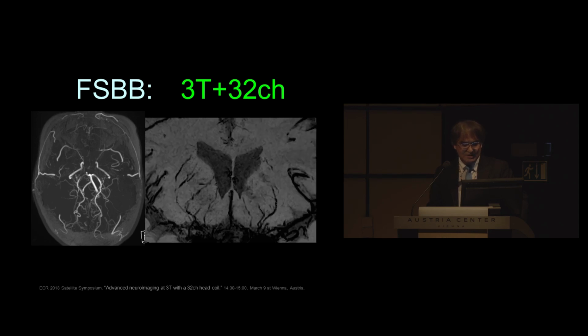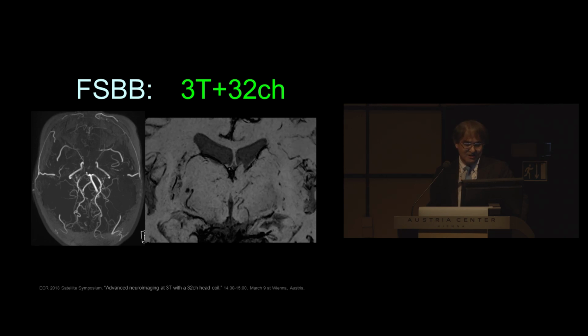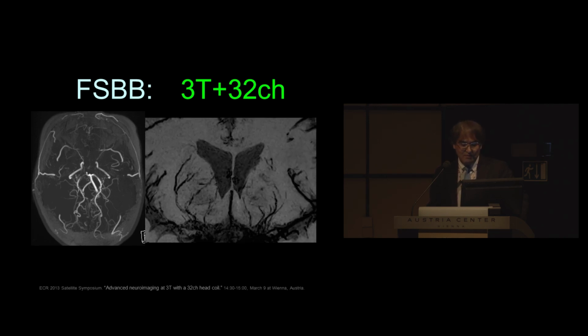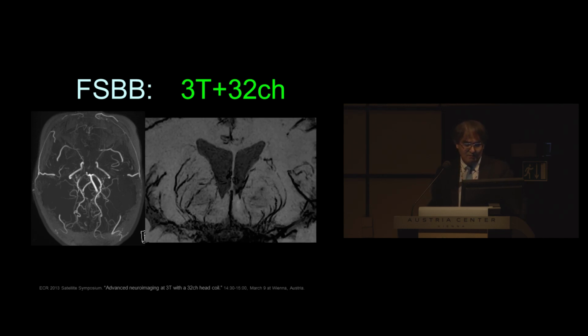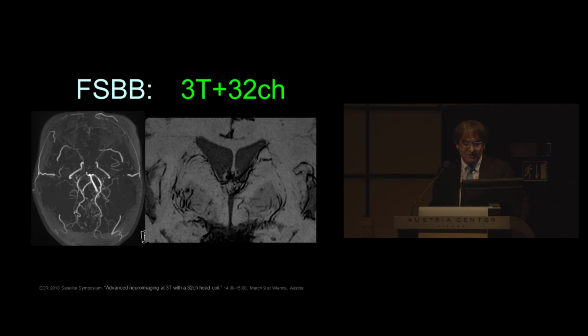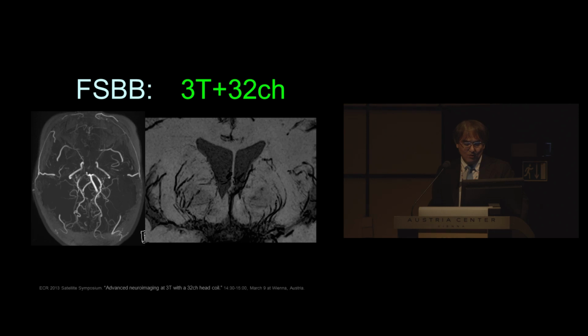Some are quite similar to the size of the M2, which is very large. And in some cases, microhemorrhage is observed, which will give us much more information, which was not visualized until now. And I hope I could do more work on it.